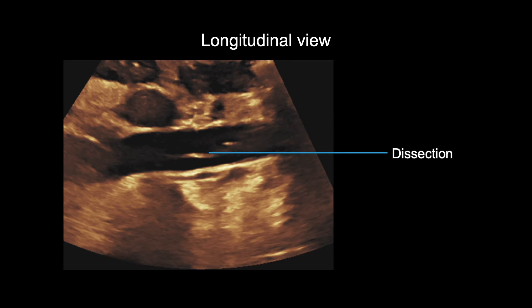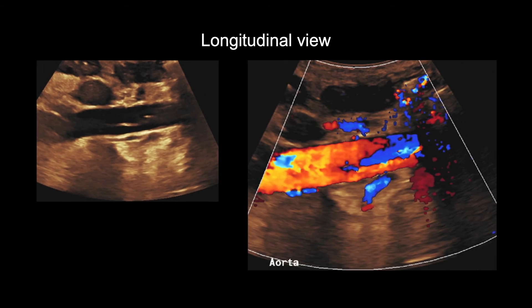This image shows the previous image in longitudinal view. Pathology should always be examined in transverse and longitudinal views to confirm results in different dimensions. One of the main reasons is to ensure that there is no artifact, which is common in ultrasounds. This is the same longitudinal image with color. Note the circled separation of flow into red and blue colors in the area of the dissection.